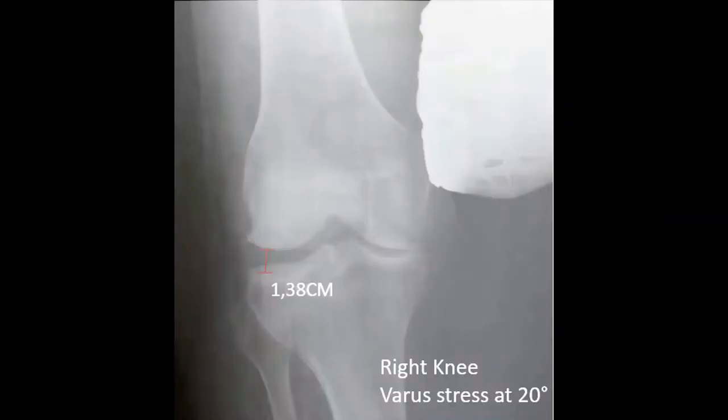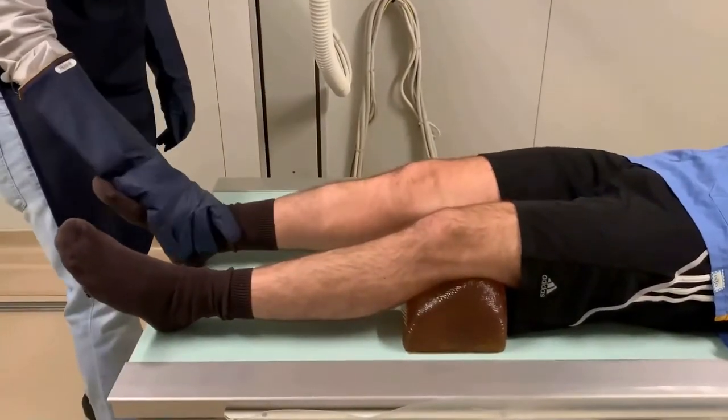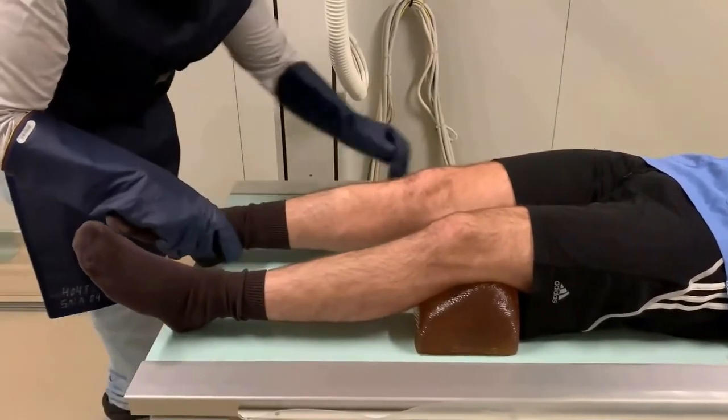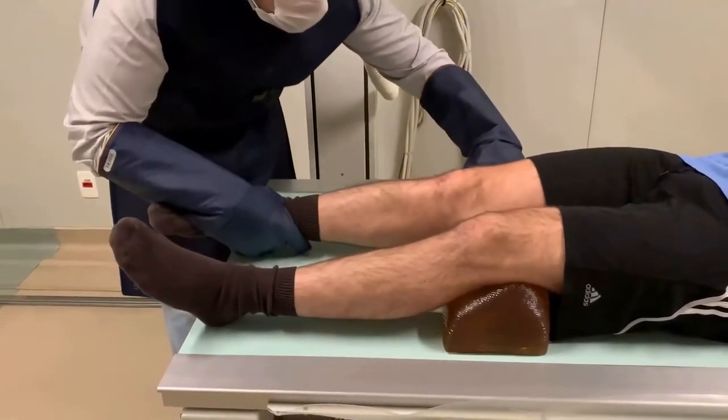We correct the rotation, identify the interline, and perform the varus stress X-ray, observing a 1.38 cm opening. We then perform the valgus stress with 20 degrees of flexion, observing an opening of 1.60 cm.